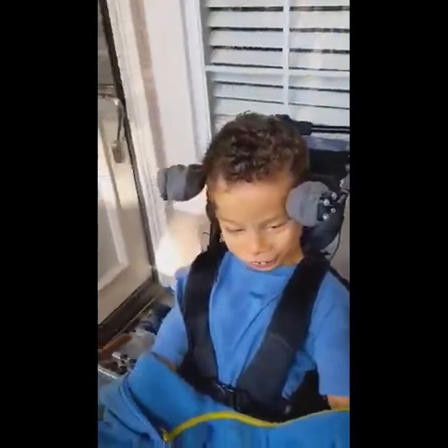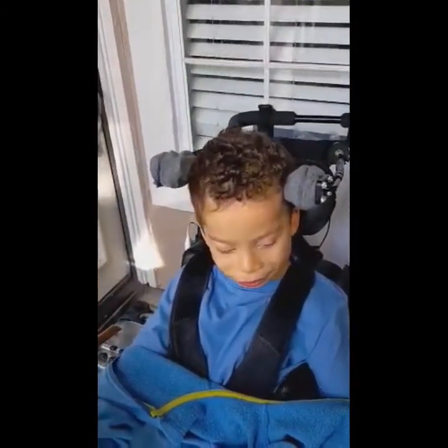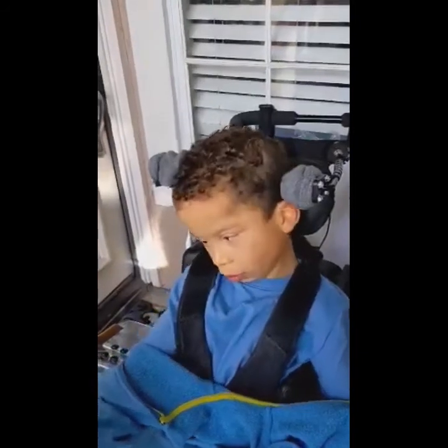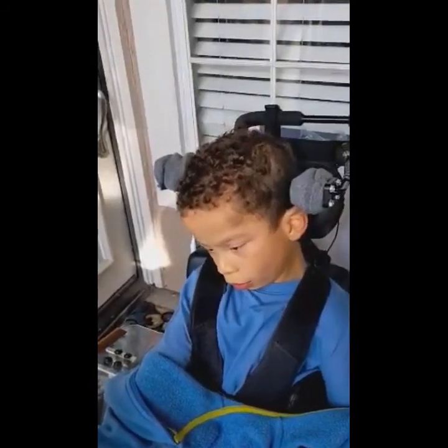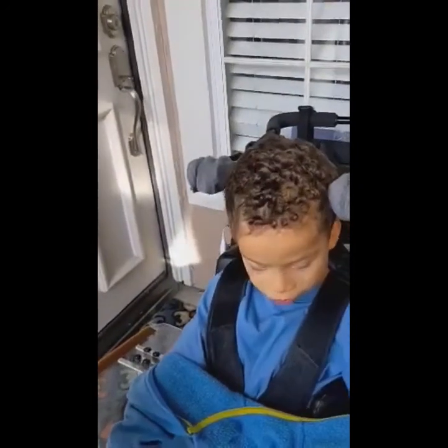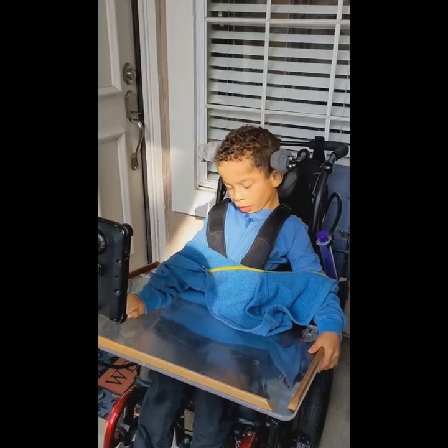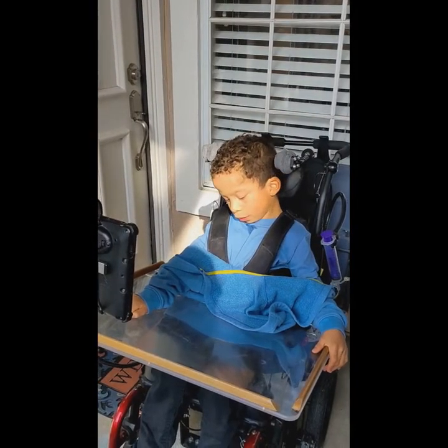So where's your mover switch again? How does it work when you're moving through your choices? I forget which side you're pressing on. Okay, yep, that. So he turns right and presses that button right to the right of his head. And that's the one on the left of his head to pick his choice. Tyler, what's your favorite toy? What's your favorite thing to play?